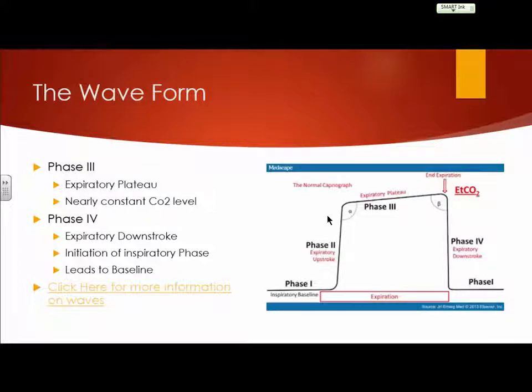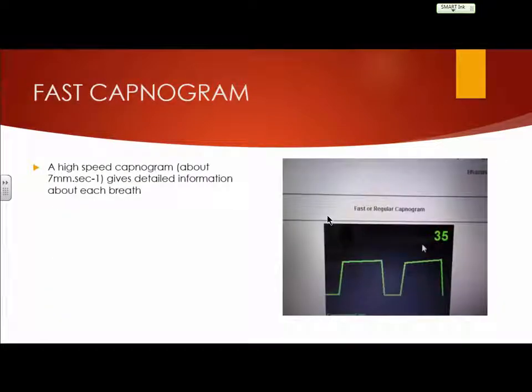Let's see if I can do this. Let's imagine I'm at my peak there, so I'm right there, all right? So, here I go. Make sense? Did y'all see that? Does that make sense? All right. So, this is called a fast capnogram.